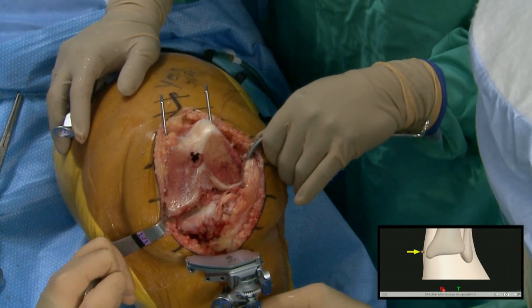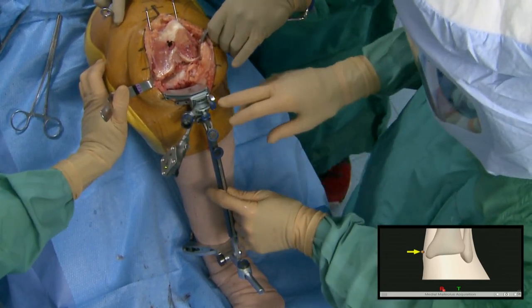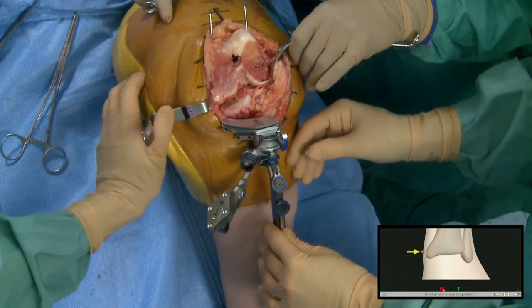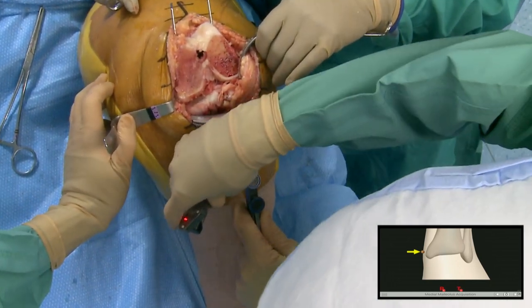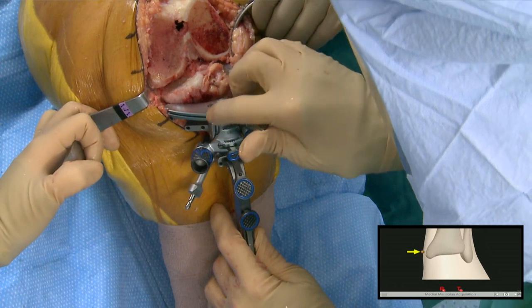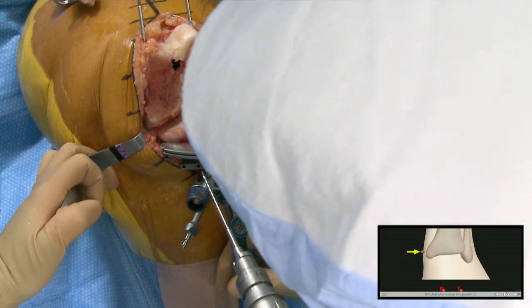This is the normal extramedullary guide I would use if I was not navigating, but the block is a little different — it has the same adjustments: flexion-extension, varus-valgus, and depth — plus the tibial tracker for navigation. I set it up pretty close to where I want it normally. I put a flat edge on the patient and look from the side — looking at the preoperative lateral she's probably got about five to seven degrees of posterior slope and I'm aiming for three, a little less than her native slope.